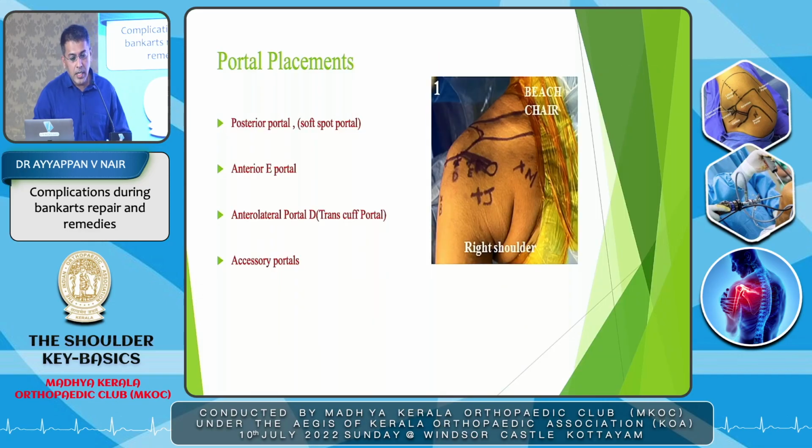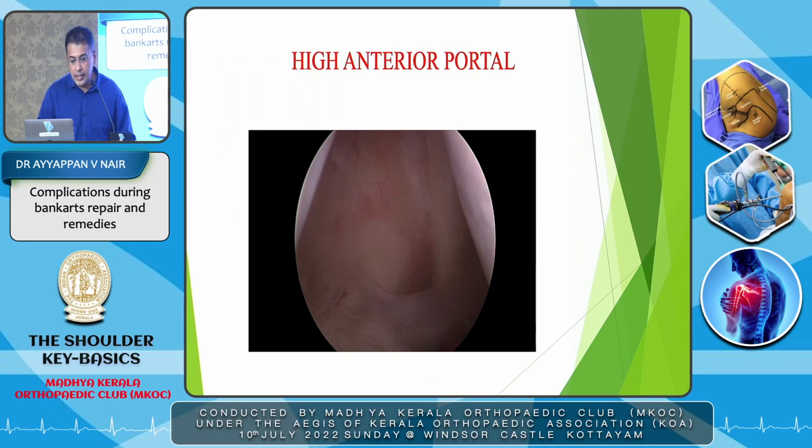Coming to ports, as I was mentioning, the ideal way to put the port is with the needle and then inside. These are different ports which I normally use. The posterior ports I've already mentioned, and these are the anterior ports. Once we made the posterior port, we are inside and we have done our diagnostic round. Here the problem is, as Dr. Shyam and the others have mentioned, that getting to the 6 o'clock position sometimes can be difficult.